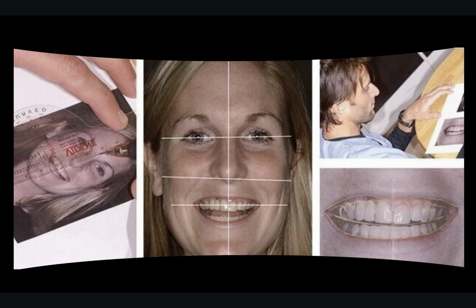You have the seeds of things like digital smile design with people like Christian Coachman, who were traveling around the world and really developing their workflows in this analog digital hybrid, where they would print off the digital photos and mark them up.